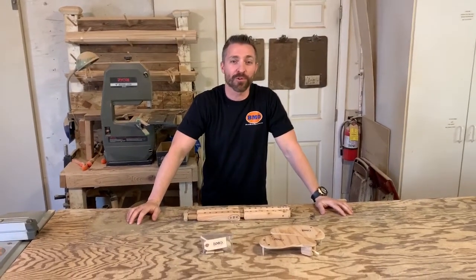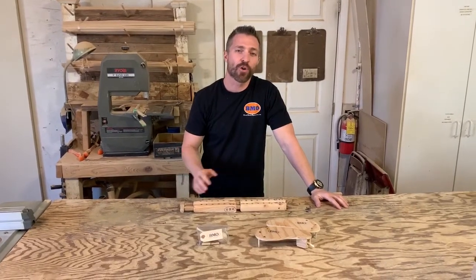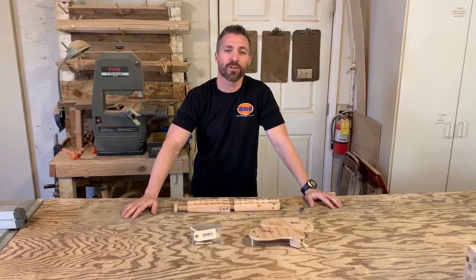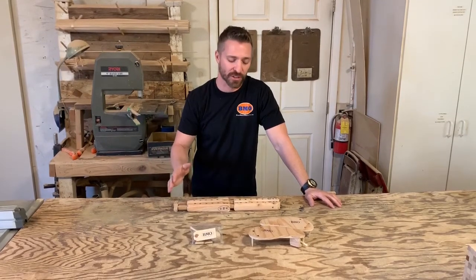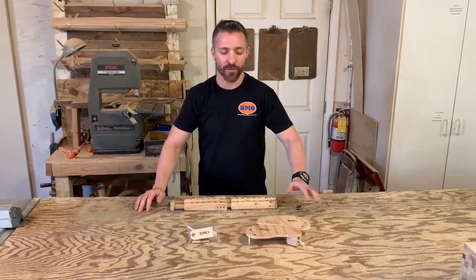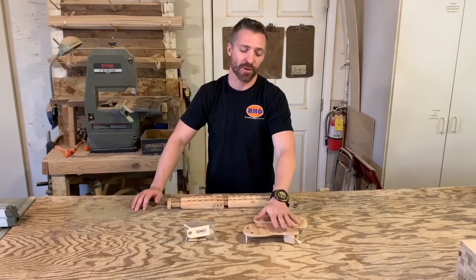Hey guys, it's Dr. John from Bob Medical Organizations — that's BMO — we manufacture post-mortem prosthetics. We've been doing our series of instructional videos and we've been doing a lot of insertion instructions. Today we're going to continue our upper extremity series and we're going to really focus on our SRP, which is our scapula or shoulder replacement prosthetic.